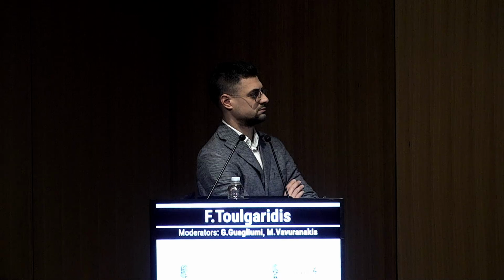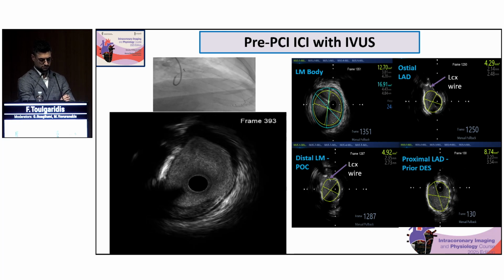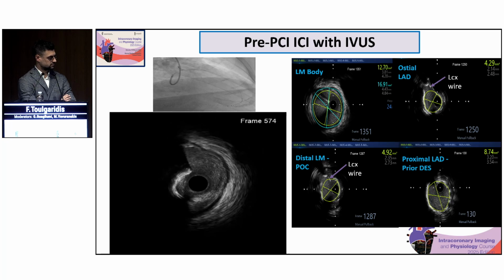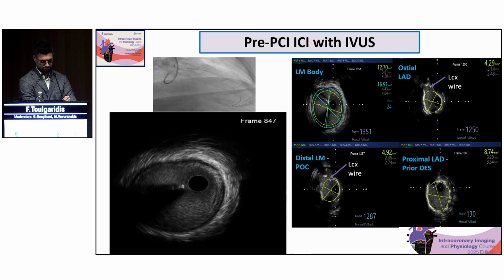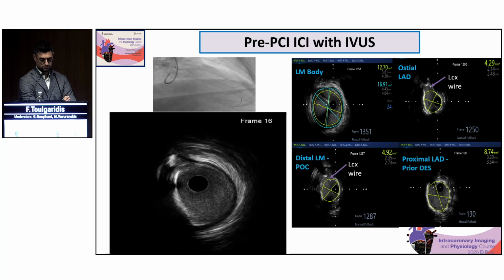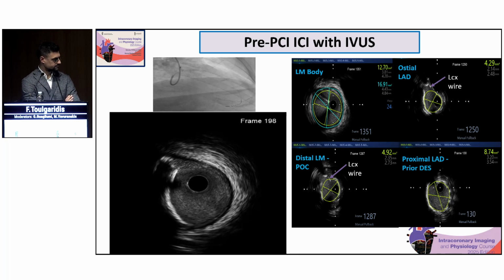Yes. On the pullback. So let's activate the pullback again, okay? So very important also to have a look at the measurements. The mismatch between the proximal LAD and the left main. The left main is huge. In yellow, you have the lumen. In blue, you have the vessel, so you have some calcium there, you see, calcium and then there comes the circ. Circ is coming on the top. It's not bad on the top, yes. There is a little bit of calcification, but by definition, not bad. Yeah. And you can see that the ostium of the circ is going to be, by measurements, at 4.92. And the left main at the proximal is okay, I think. I didn't see any. Correct. Any proximal mid seems to be okay.